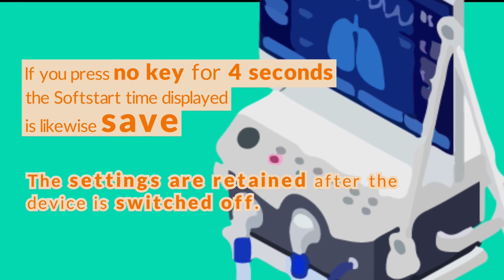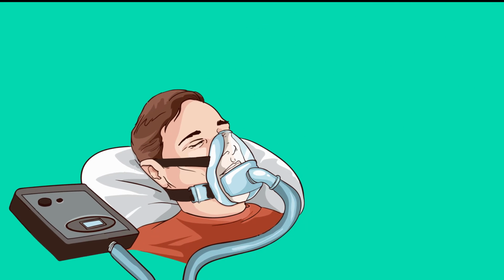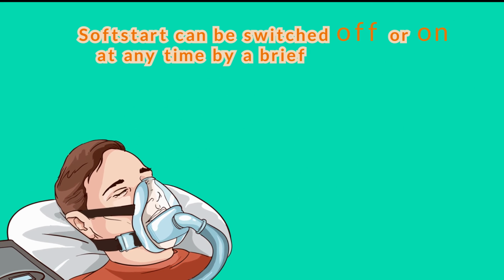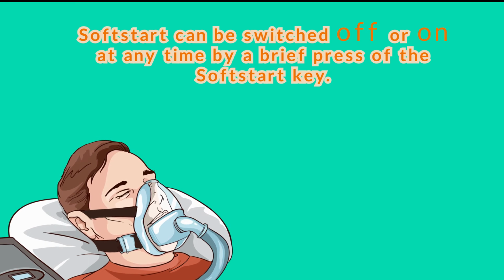The settings are retained after the device is switched off. The device automatically starts in soft start mode if this was activated for the previous use. Soft start can be switched off or on at any time by a brief press of the soft start key.